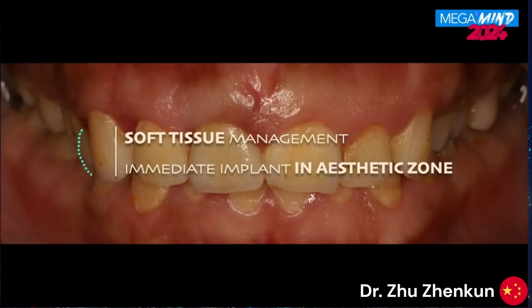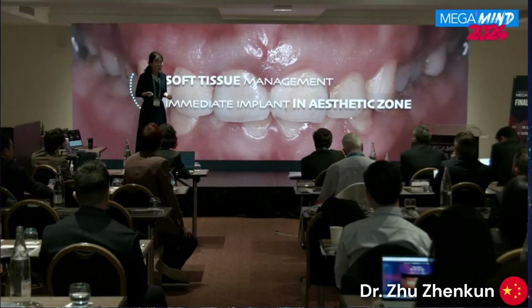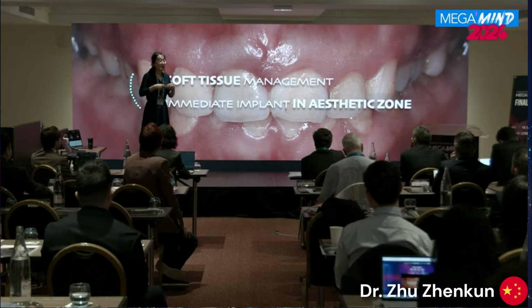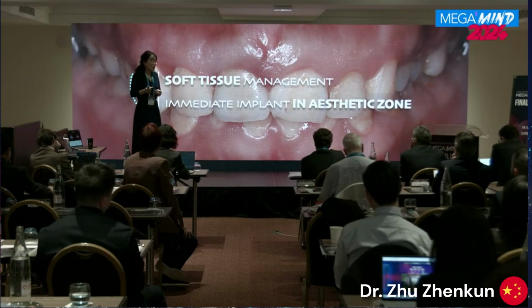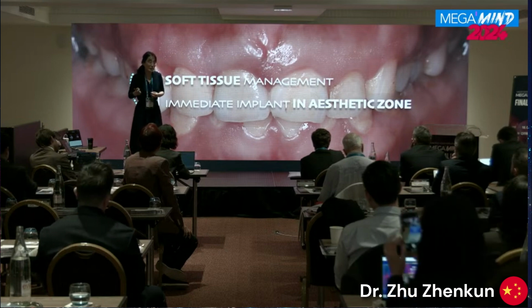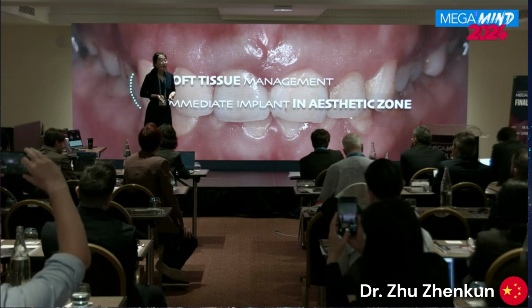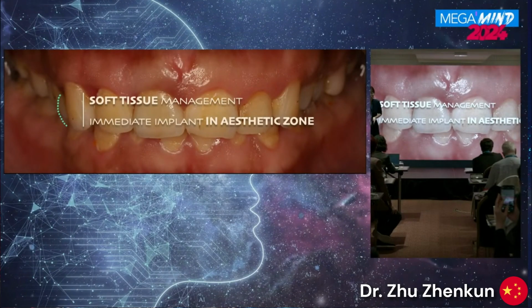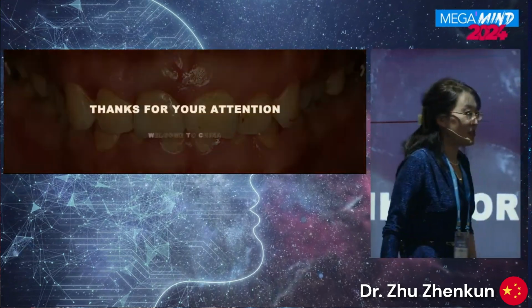That is why I think everybody already has the answer. That's because with the CTG, with the soft tissue graft augmentation, and with the specially designed restoration, soft tissue regeneration is possible in the area. So all of these tries compensate for the buccal bone resorption. Okay, that's all. That's the case today.